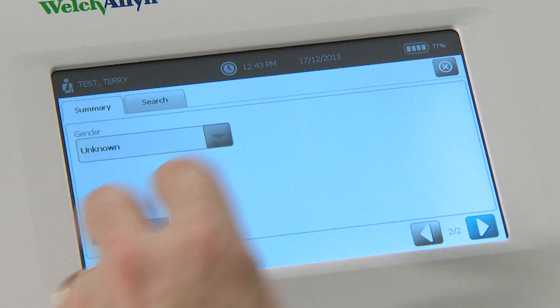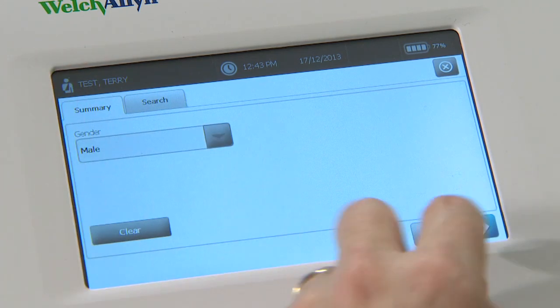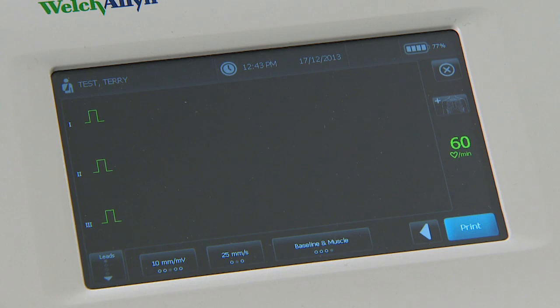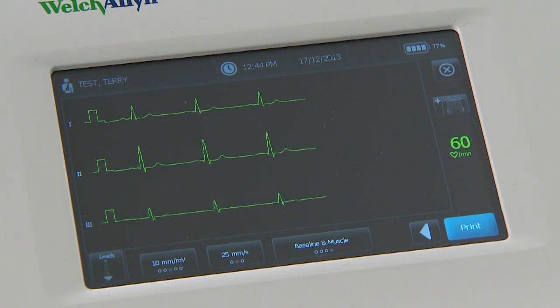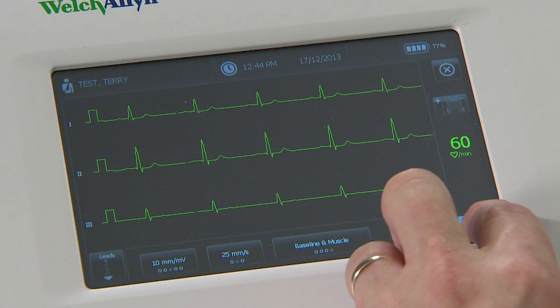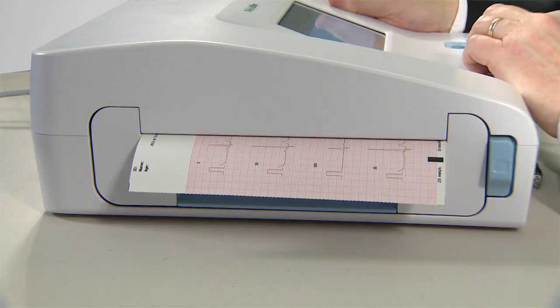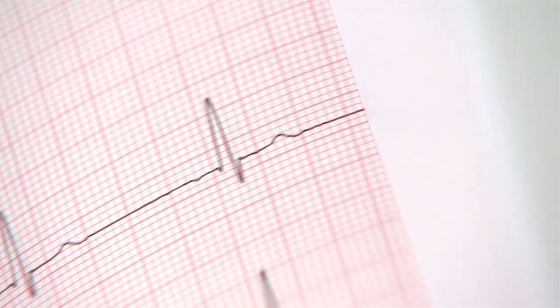Press the forward button and enter the patient's gender, then press the forward button again. You can preview the ECG traces in real time. When you're ready to take the test, press the print button and the unit will print out an A4 12-lead ECG report with interpretation.